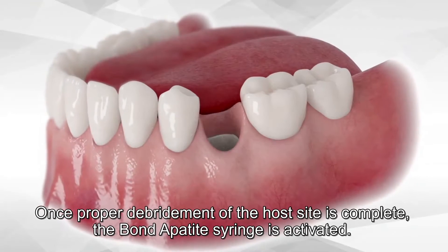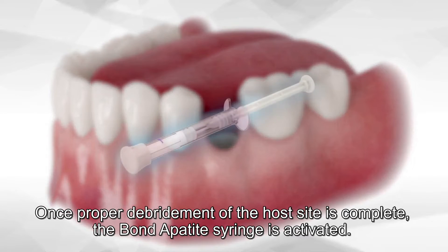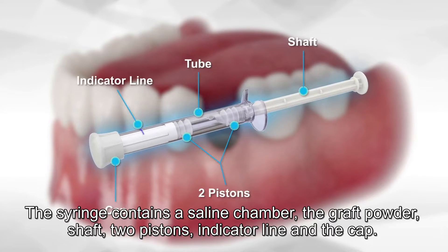Once proper debridement of the host site is complete, the Bond Apatite syringe is activated. The syringe contains a saline chamber, the graft powder, shaft, two pistons, indicator line, and a cap.